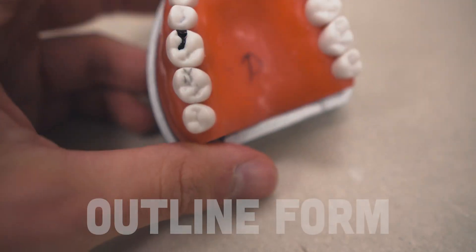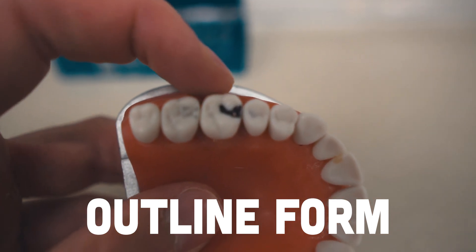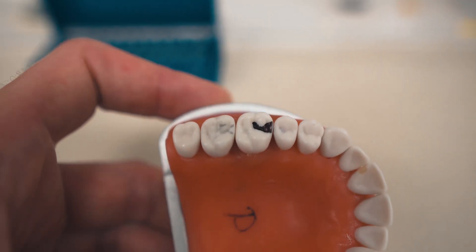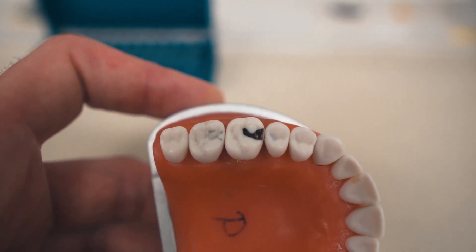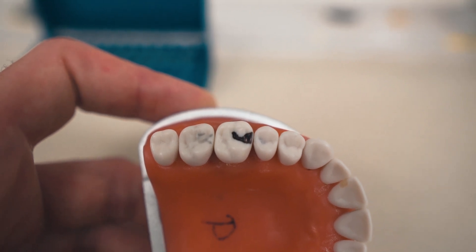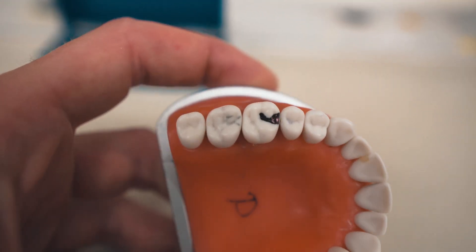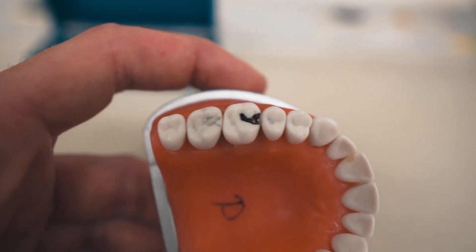I've gone ahead and drawn my outline form here. This is number three — the occlusal portion is pretty simple, just riding up into the buccal groove a little bit, then an easy transition straight on the lingual all the way out, and then a little bit of an S-curve on the buccal. You want 90-degree exit angles of course. I'm going to start with the occlusal surface and work my way out to the box portion. Very simple outline form — I'm not using a rubber dam. Now I'll set up and show you my posture and how I approach the patient.